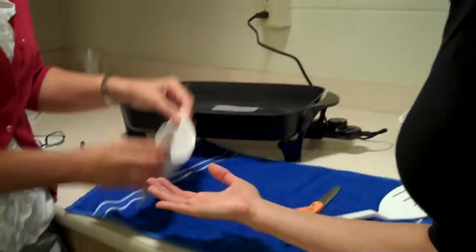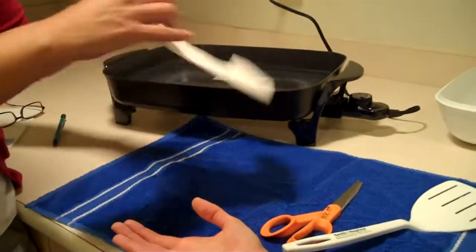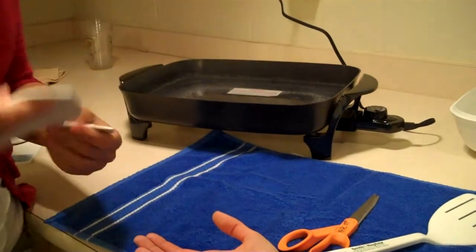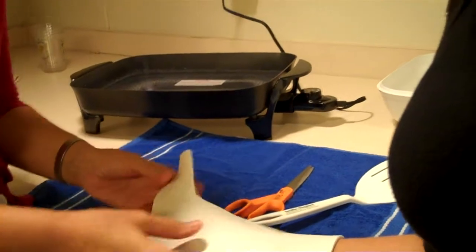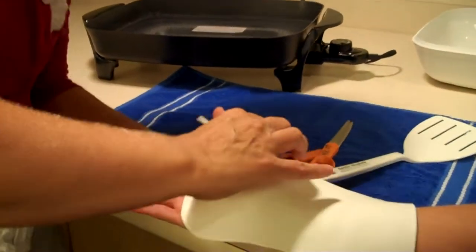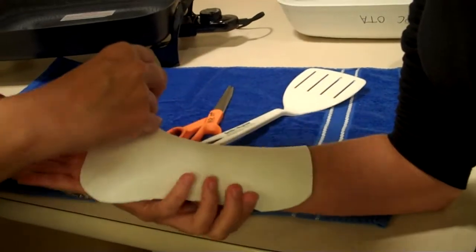First thing you need to do is dab it off, get rid of the excess water. And again, remember, this guy's going to be a little big on her. Okay. Ow. Way to go, Steph. Now you got to work kind of quickly.